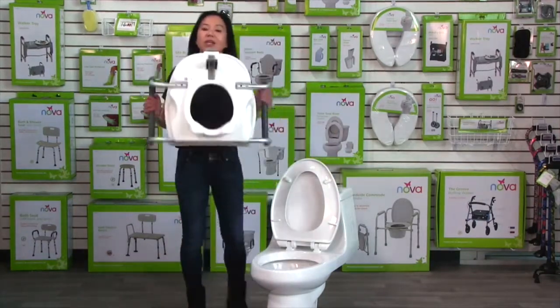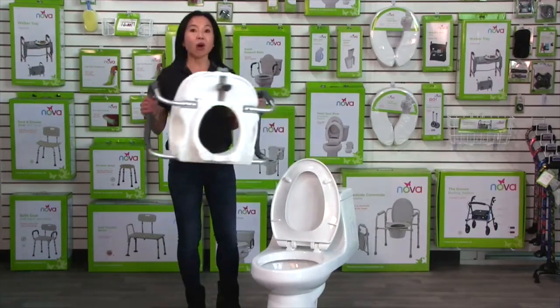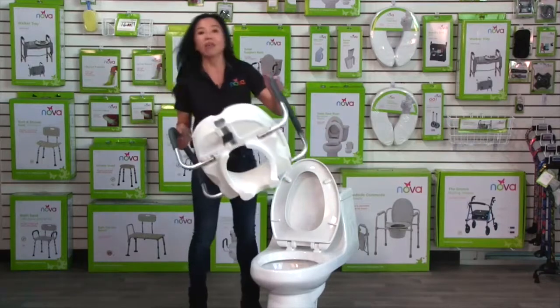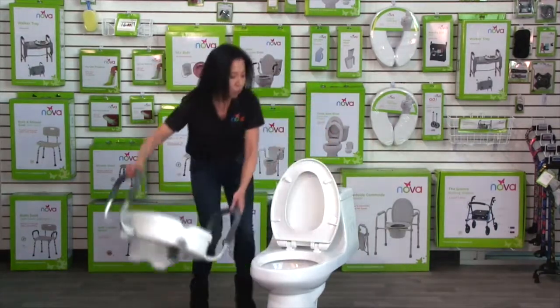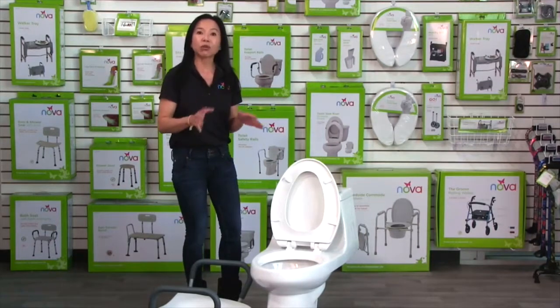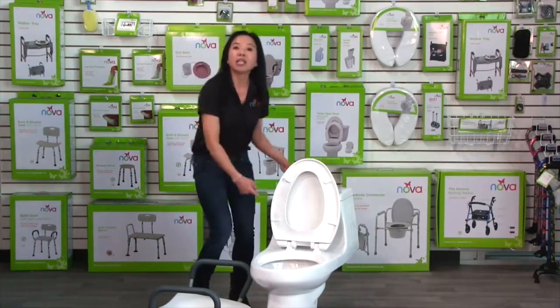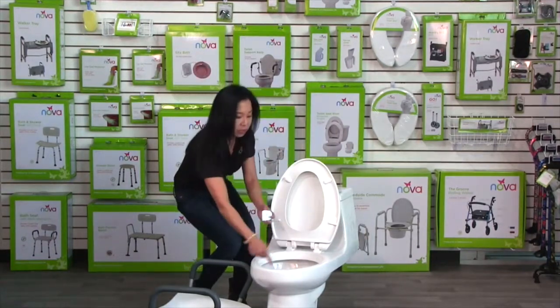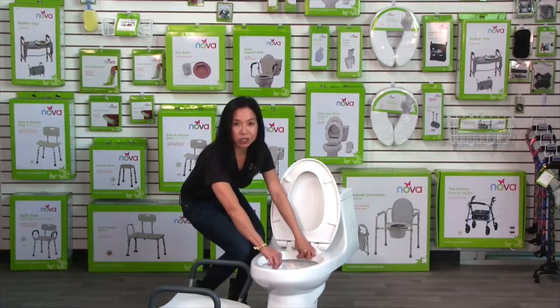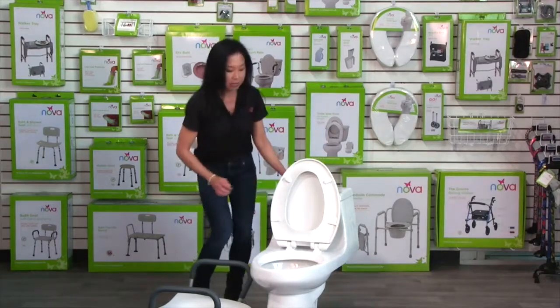This raised toilet seat just comes with the arms and all you have to do is pop them in — assembly takes just a few seconds. Then to put it on, you want to make sure your toilet is compatible. This fits most standard and elongated toilets where the inner rim from the front to the inner rim of the back does not exceed 14 inches. That's the measurement you want to take.